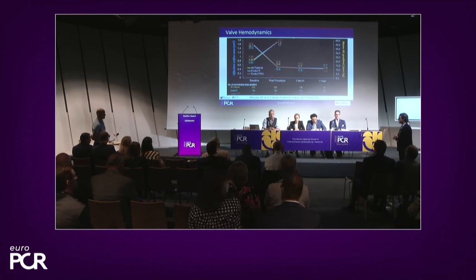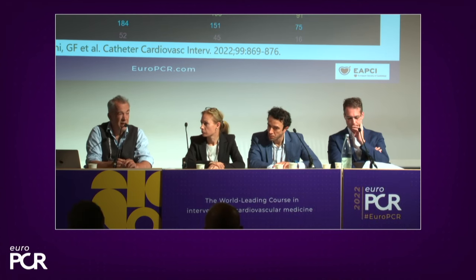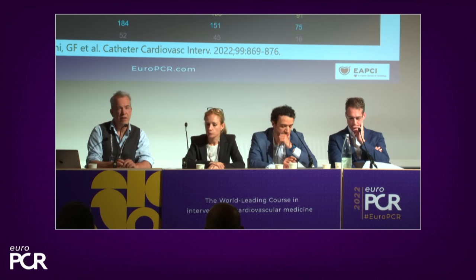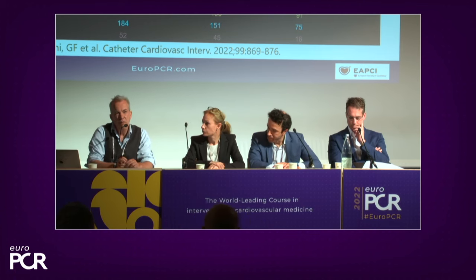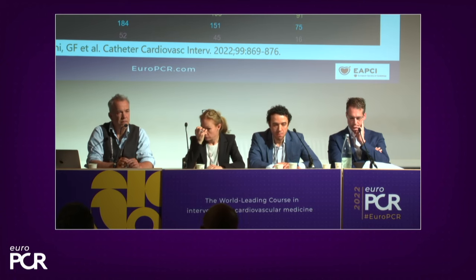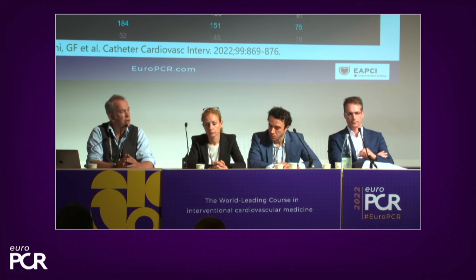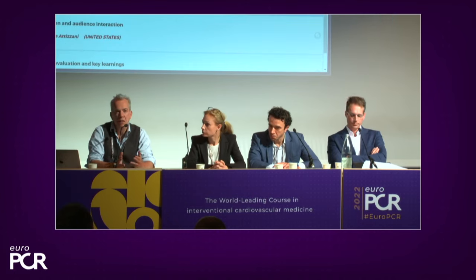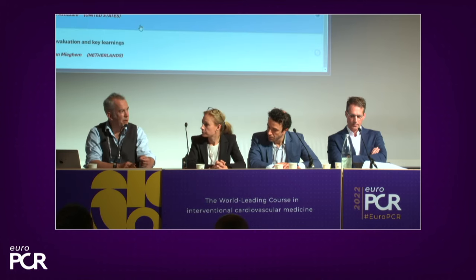I'll take it. I think it's much easier to position than a native valve. For predilatation, you definitely risk having some emboli. In the native valve, sometimes you have difficulty because there are really bulky calcified leaflets. In this setting, I wouldn't be keen to predilate, even with the cerebral protection filter in place, because of course it doesn't protect the whole brain. As far as positioning, you saw there nicely, they don't have to use any angiographic contrast. You aim for which node you think is going to be the right one, depending on where the coronaries are coming off, and then you implant the valve, as they nicely did, under rapid pacing. So fundamentally, in execution these are very straightforward procedures, but in planning, they're much more complex.